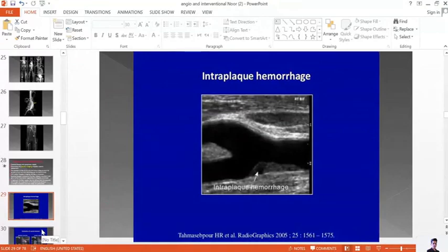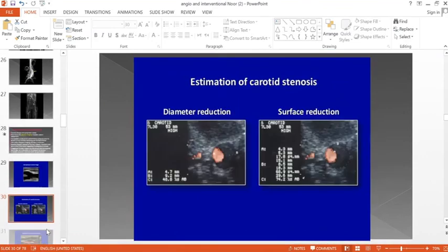By Doppler, we mean we start by putting our ultrasound, we call grayscale image. So we assess visually the vessel. This is the common carotid dividing into internal and external carotid, and you notice here the presence of this plaque. So we can assess the plaque and we can try to quantify the degree of stenosis, first of all, starting by only the grayscale.